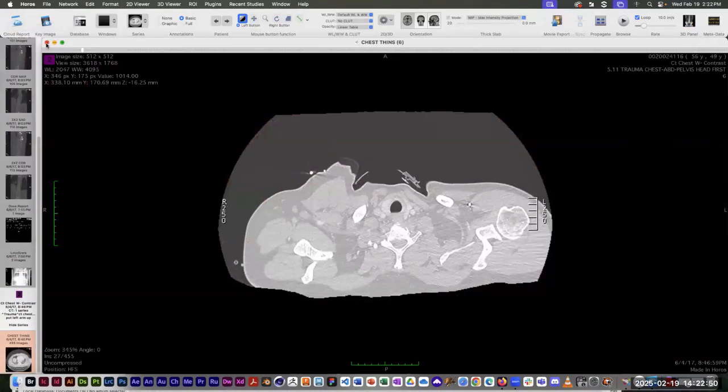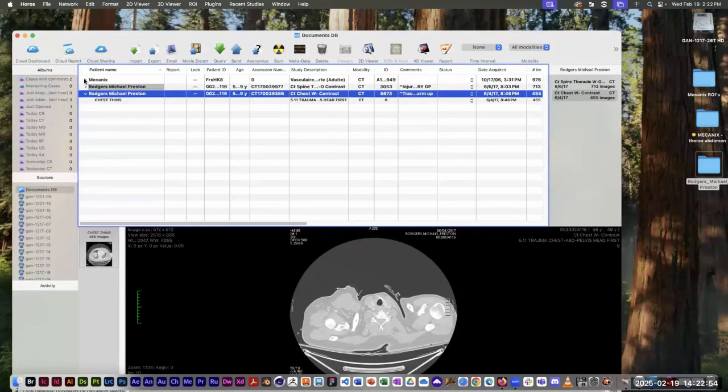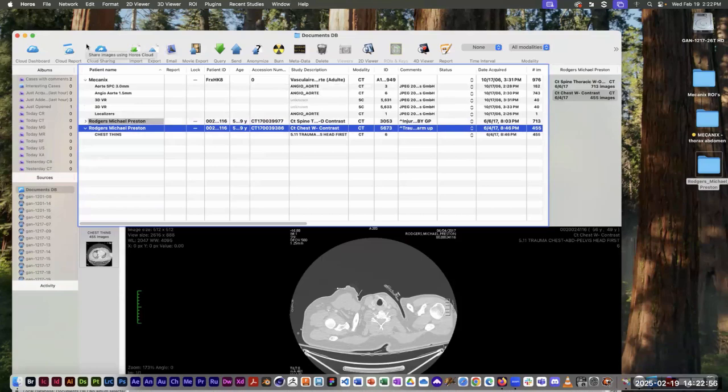All right. The other thing I want to do today, the main thing I want to do today, and what your exercise is all about today, is segmentation. And somebody shout out to me, Mike, did I hear correctly that you may have done a little bit of this with Glenn using Slicer? Okay. So you know the basic idea of what we're doing here.